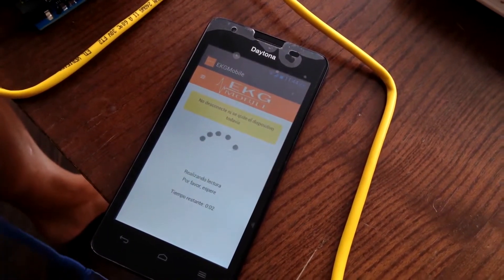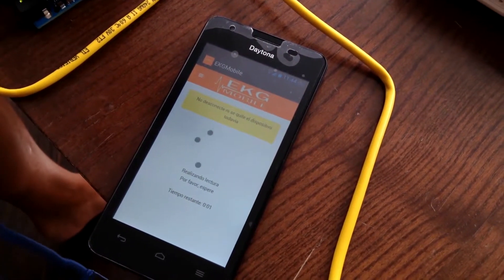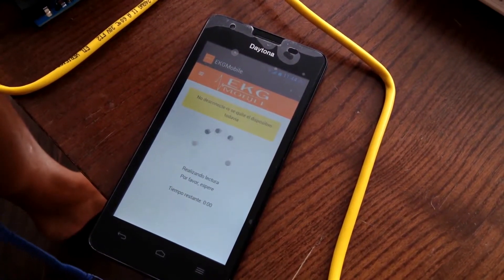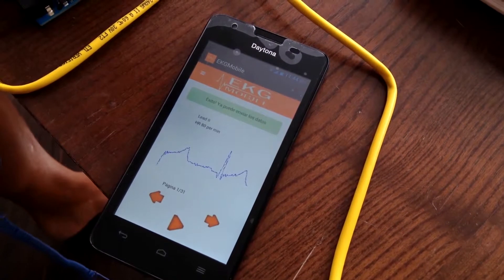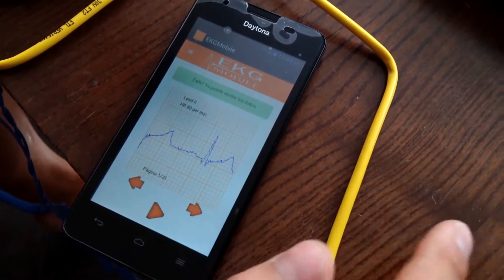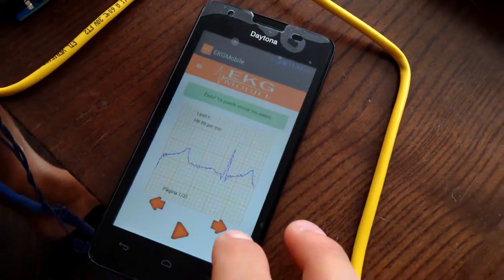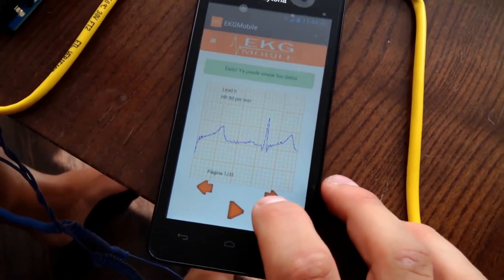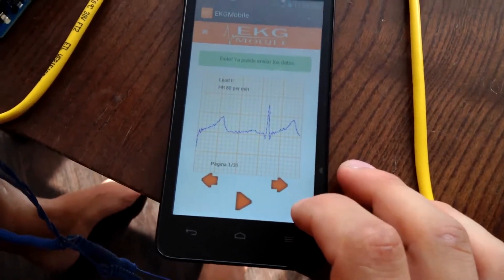After the measurement, the graph appears on the screen. We can interact with the graph and display all the information.